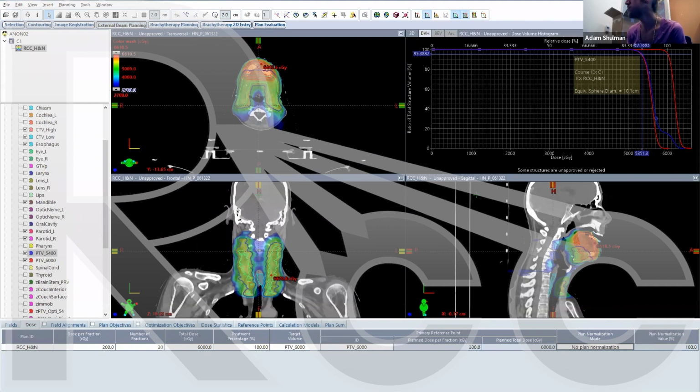Another question I see about skin flash. So maybe we need to have a session to cover this explicitly. We use this definitely in chest wall patients and breast patients using VMAT or IMRT, and it is helpful. We use it all the time in our vulvar patients, and in other cases we'll use it. Lots of times for head and neck, we don't use flash just because we've got a mask and it keeps the patient in position pretty well. We're not too worried about it. If you are worried about growth of tumor or swelling, you would want to add flash. And again, we can think about adding a small section on just flash to our RCC curriculum from all the questions. They're very good questions though.